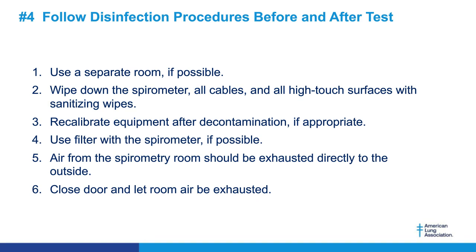Now, if you're changing the pneumotachs or internal parts of the spirometry equipment, you need to recalibrate the equipment after decontamination if it's appropriate for the manufacturer. We always use a filter with our spirometers. Now, there are some spirometers that don't have filters, and all of those spirometry companies are racing around to figure out a way to get a filter that works with their product.